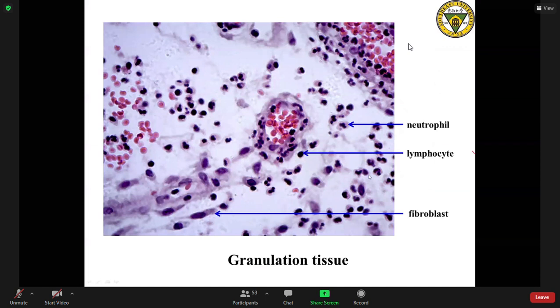Okay. Capillary. We say the newborn capillary. What is newborn? It means the capillary may have an incomplete wall, so some fluid, the blood serum, may be exuded from the uncovered endothelium. So we often see this empty area has some fluid.